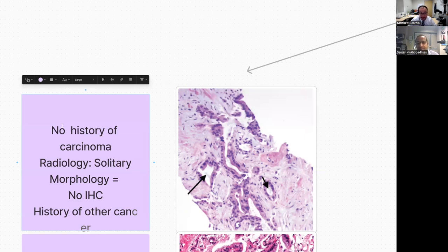Yeah, so I completely agree though. This doesn't need a lot of stains. It's completely reasonable to sign it as an adenocarcinoma. And I think we both can agree that it doesn't need a CK7, CK20, CDX2, Pax8, GATA3, Vimentin. It doesn't need a huge tray of immunostains. You're just wasting material that could be useful for the patient for targeted therapy. No, I agree.